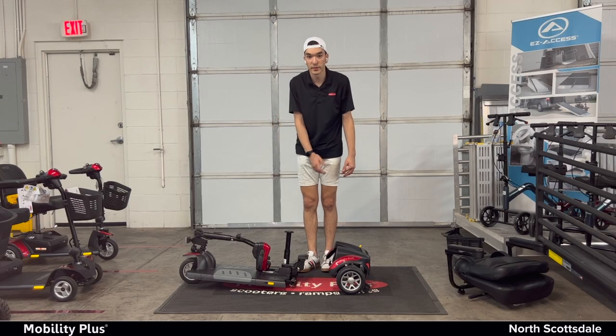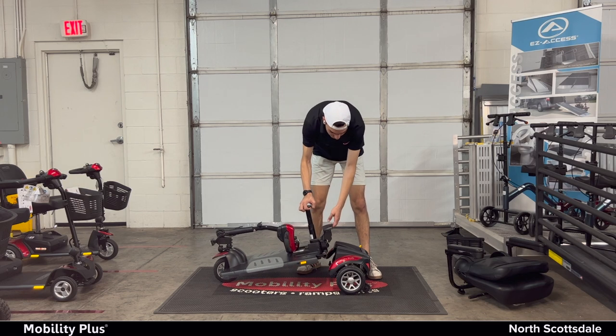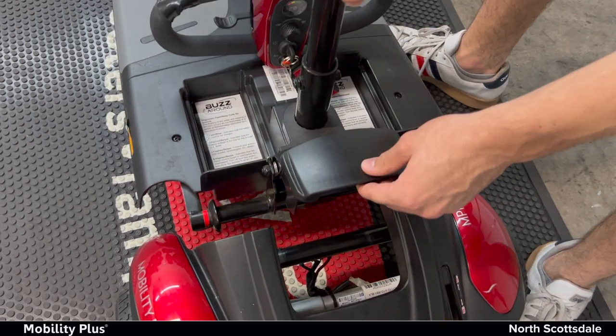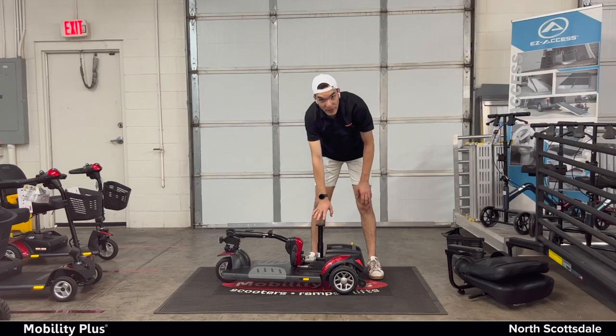Now we're going to do all of that backwards. To reassemble it, simply take this back part again. Make sure that it's lined up with the red lines — latch up with the red lines. Slide it back in and you should hear it snap into place.